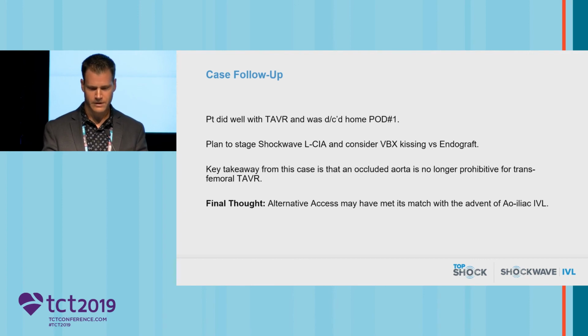transfemoral TAVR. Final thought, in my perspective, alternative access may have met its match with the advent of aortoiliac IVL.